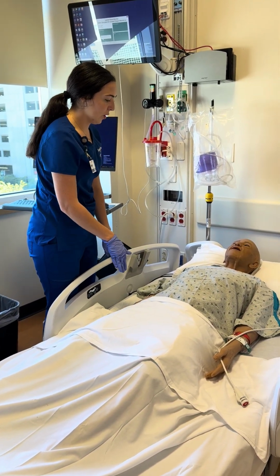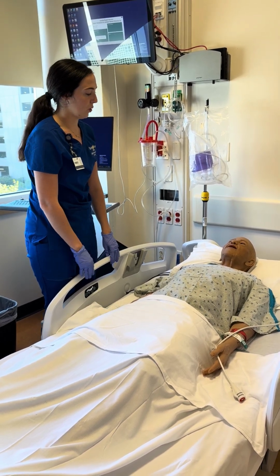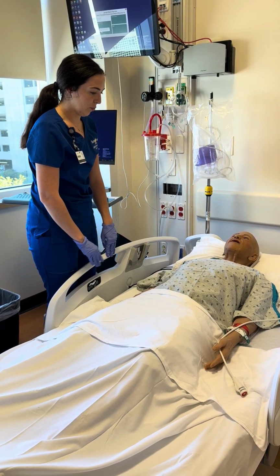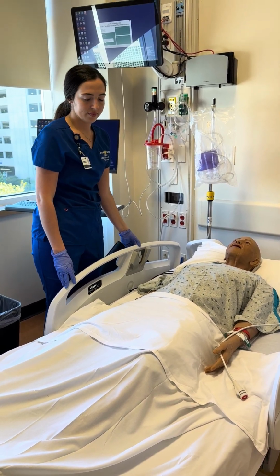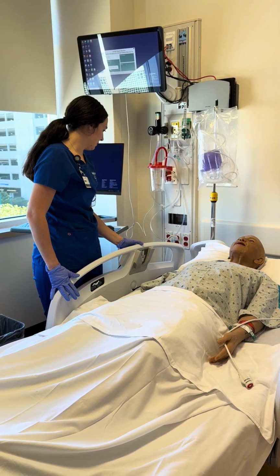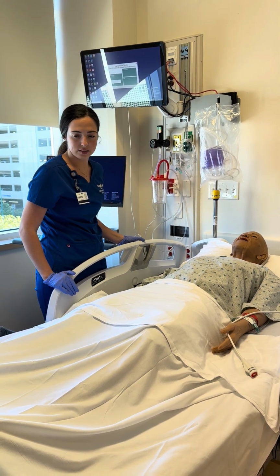Okay, so we're going to explain what we're doing today. We're going to check your blood glucose levels, and then after that, we're going to administer our fast-acting and regular-acting insulin here. So we'll get you raised to a comfortable position. Are you having any pain? No? Okay. Just lift you up here to a working level height.